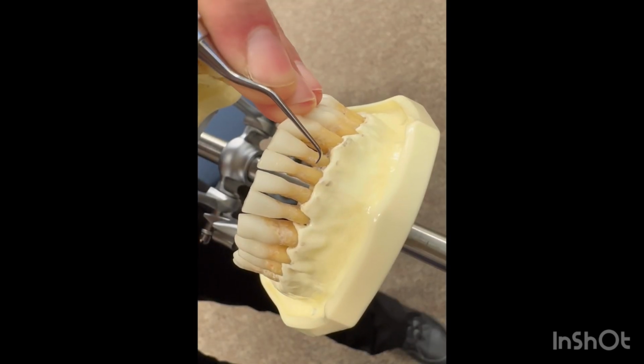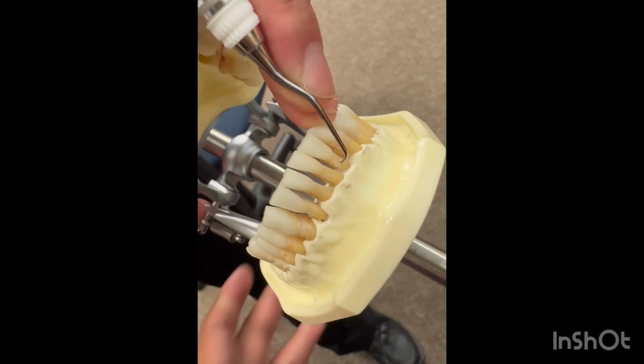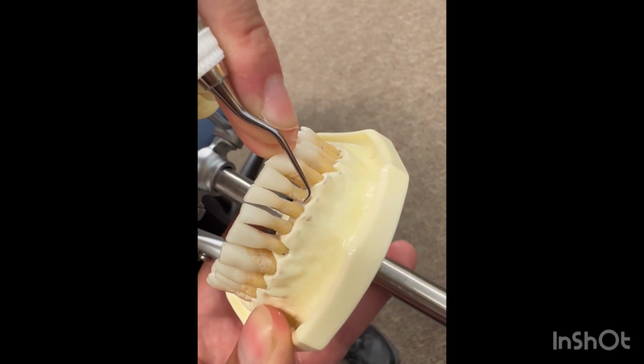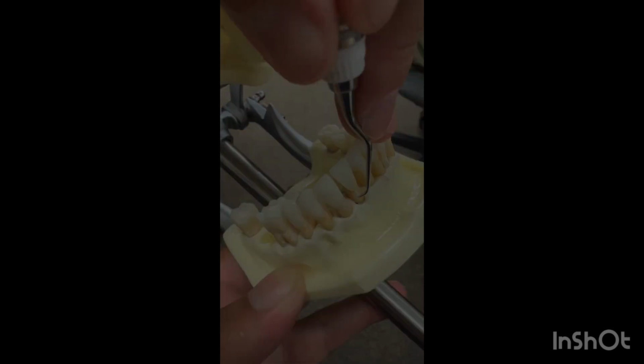For 3 millimeters of bone loss, we would switch from the 5/6 to the 5/6 mini, as it would adapt better because of its longer terminal shank, and we would continue to still use the sickle 7/8 for our mesial and distal surfaces. Here Janelle is using the 5/6 mini.